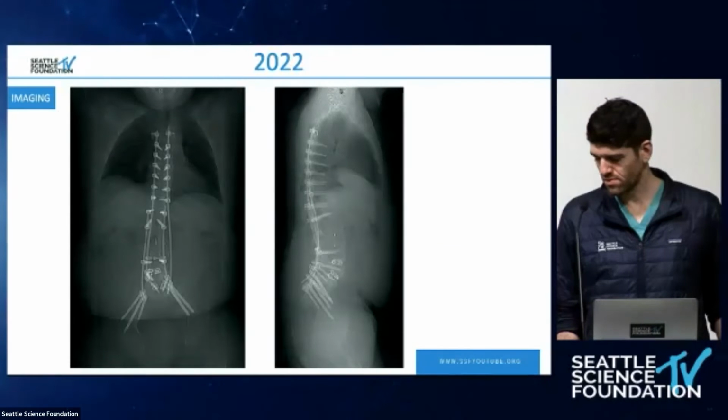After a while, I had so many broken instrumentations that I went back to Frank Shen's approach for adult scoliosis with 4 rods. My go-to in adult scoliosis is 4 rods because of so much broken instrumentation that we see afterwards, with 2 iliac screws on each side. This mitigates the broken instrumentation a little bit. Yet 2 weeks ago I saw a patient I had put 4 rods in 4 years ago, and he broke all 4 of them. Oh my God.